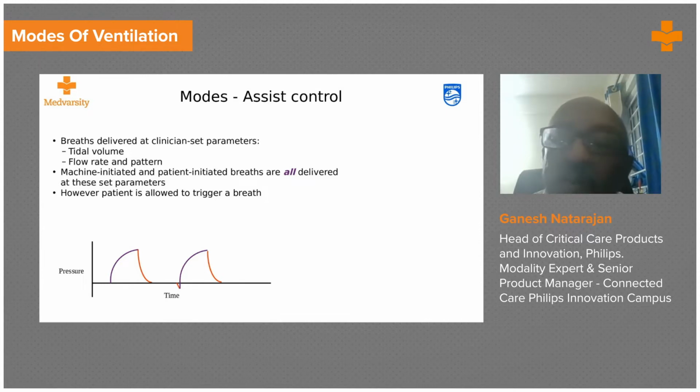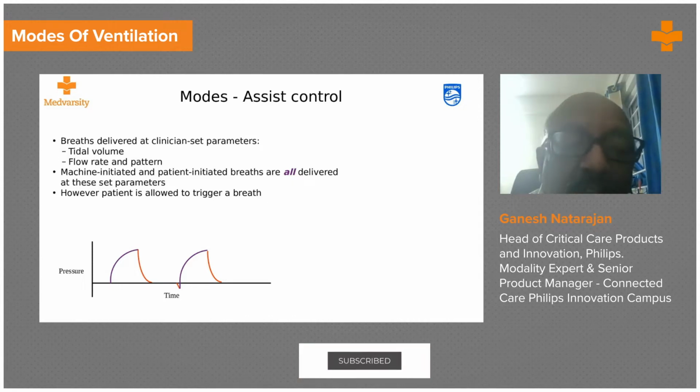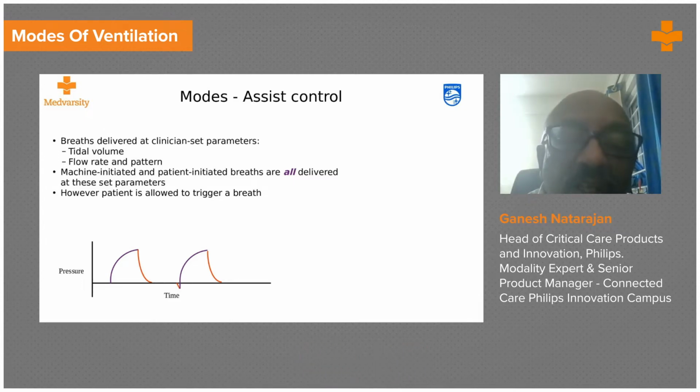If I've set an inspiratory trigger of -3 centimeters H2O, if it's a pressure trigger, if the patient is actually pulling in -3 and the expiratory time has not yet finished, the machine understands that the patient wants a breath. It prepones the next inspiratory to coincide with the patient's own efforts.